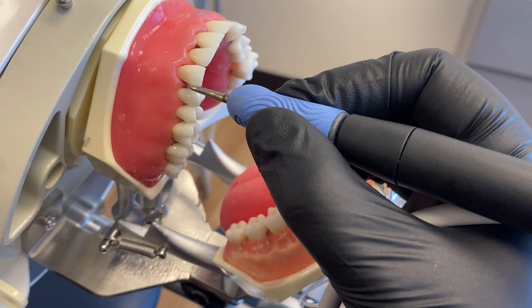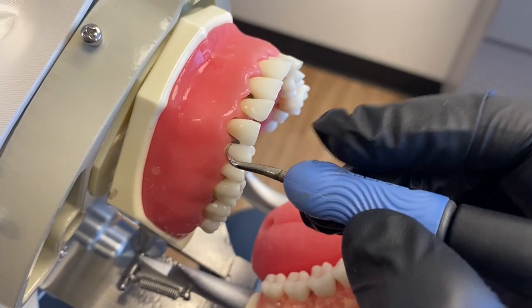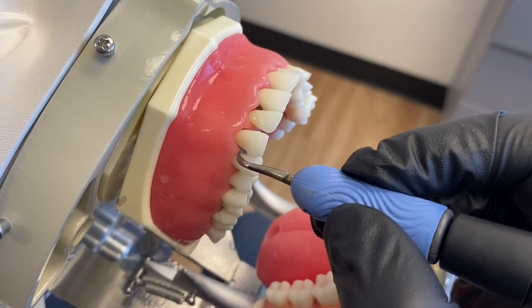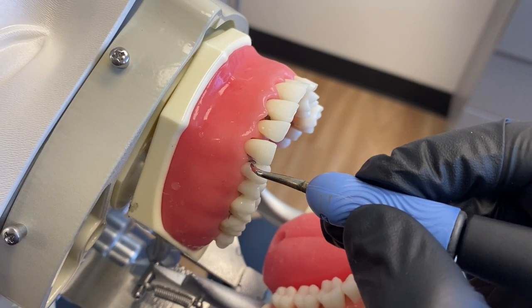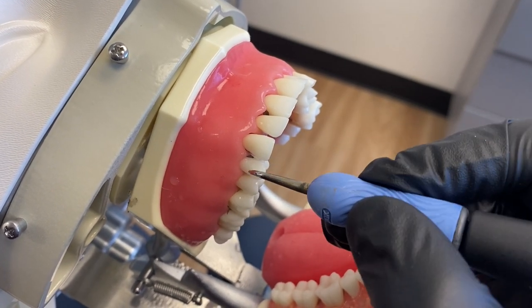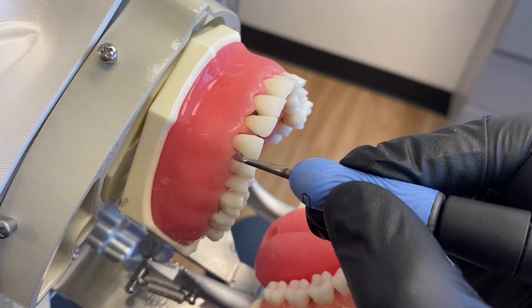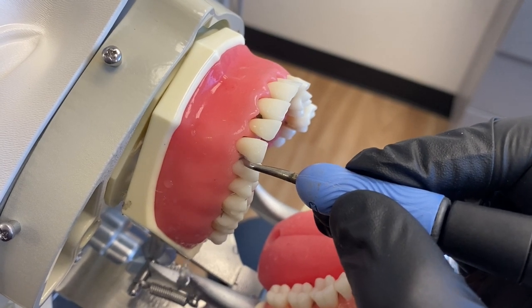As long as your tip is in constant motion, you can be in there for a while. I'm going to activate on this deposit and go down towards the base of the pocket in a curette style. See how I was in there for a couple seconds and nothing really came off — I might have to spend a little bit of extra time on these tenacious deposits to make sure they're being removed.